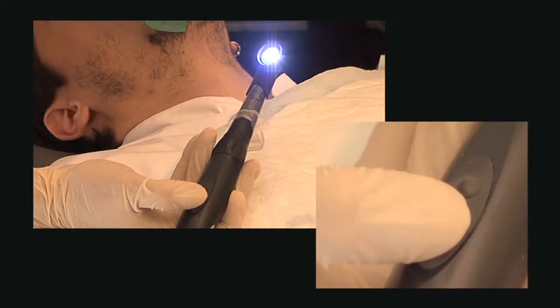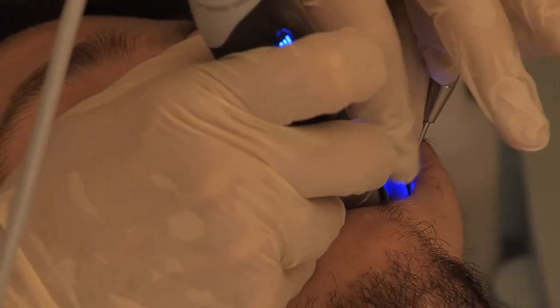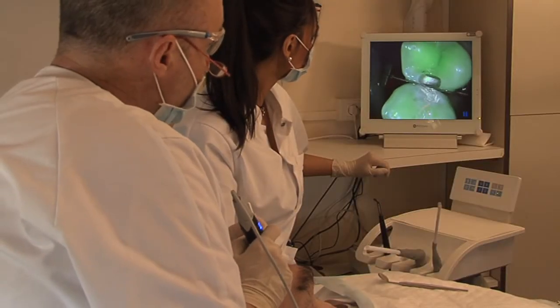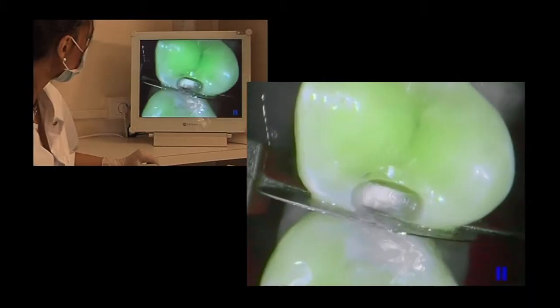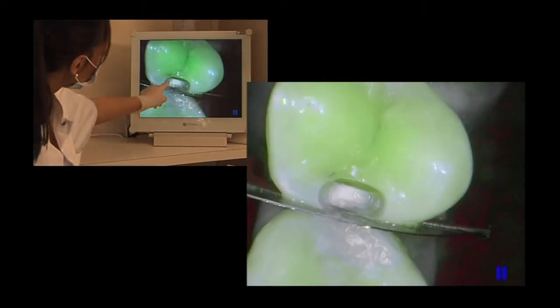In treatment mode, Soprolife will allow you to monitor the whole operation. What's more, Soprolife guides you in making your preparations. We can see a close-up of the starting point of the decayed area, which appears here.